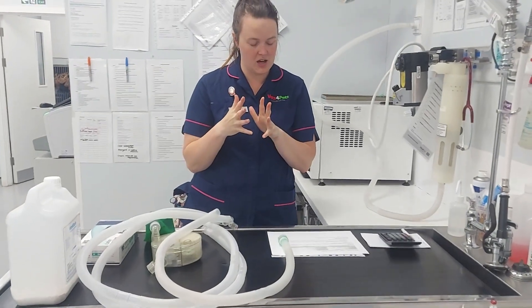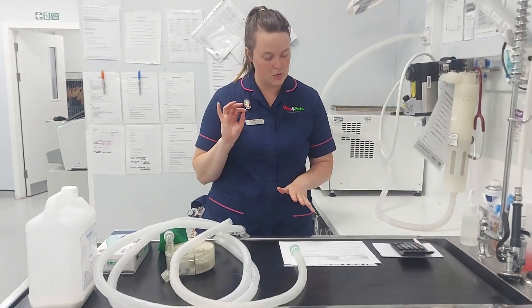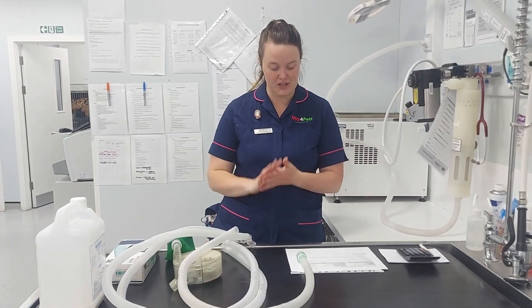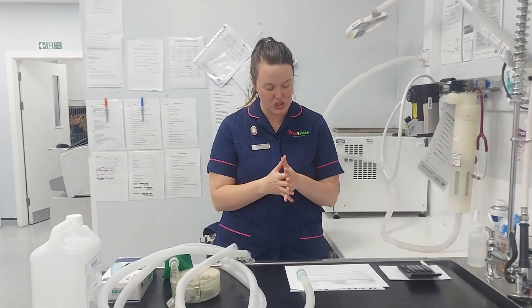We're now doing our rebreathing system OSCE, which is slightly different from ones we've done before. We are going to do our safety check, assemble the system, and use the chart provided. The chart will have body weight in the left column and a pre-calculated dose on the right, so you just choose as appropriate for your patient.